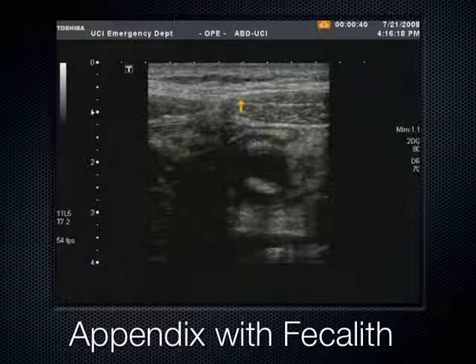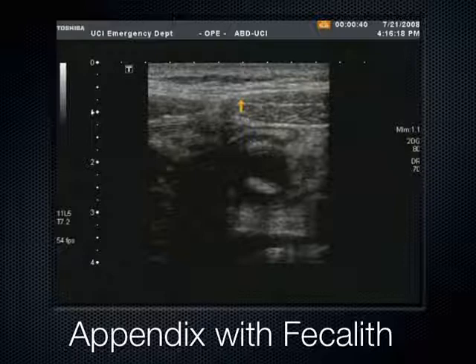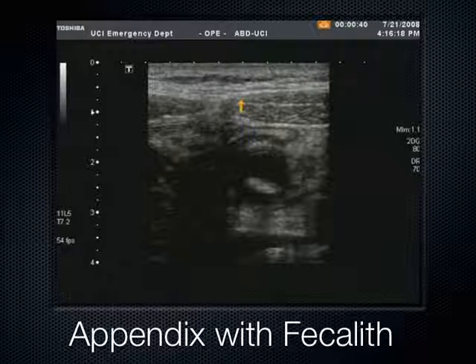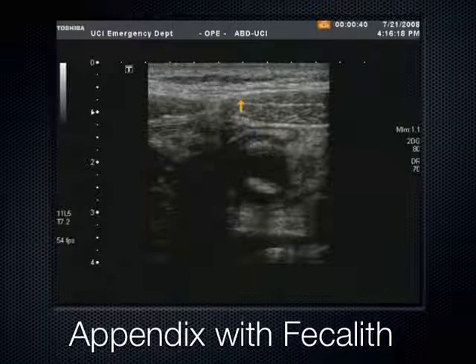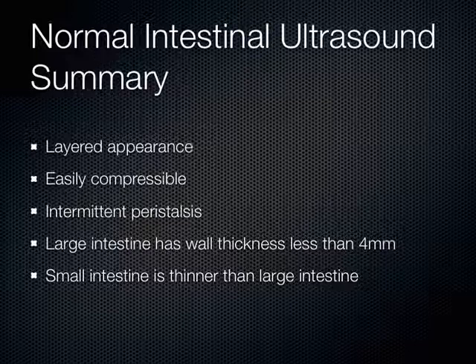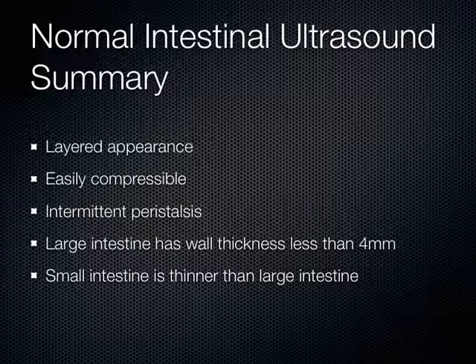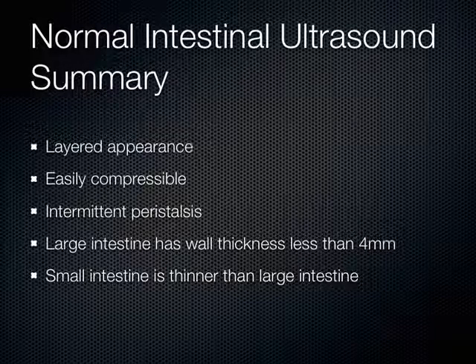To address concerns about compressing an appendix — I don't think there's enough extrinsic pressure to perforate it. The true perforation comes from the inside pressure building up. We're not pushing so hard that we're causing local perforation; we're just pushing enough to get the muscle bellies to come together. To summarize with the intestines: you want a nice layered appearance, it should be easily compressible, you should see intermittent peristalsis, large intestine wall thickness less than 4 millimeters, and small intestine somewhat thinner.